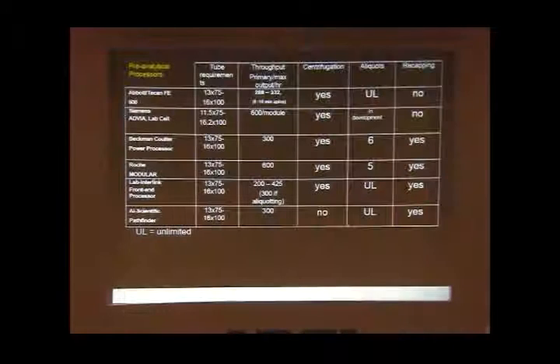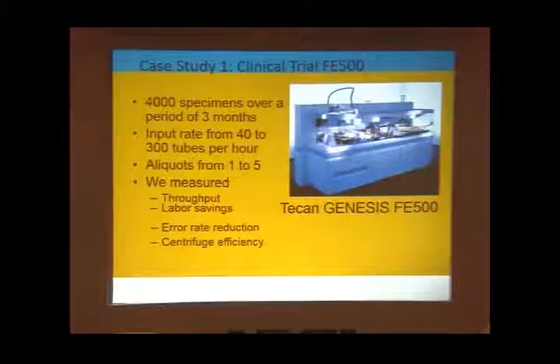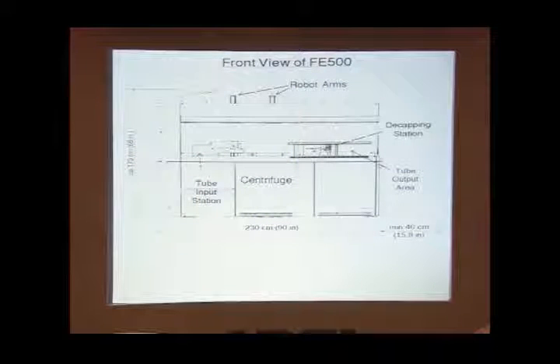So all these analyzers are listed here with their capabilities. I'm not going to go into the details due to time shortage, but if you look at a case study, this was again done in the Milton Hershey Medical Center in USA, and the results were, this is the kind of pre-analytical system they use, including a centrifugation.